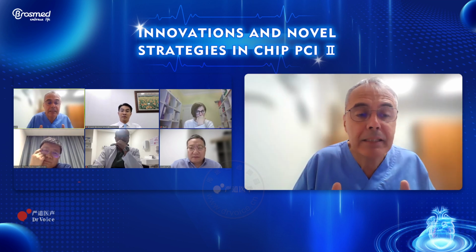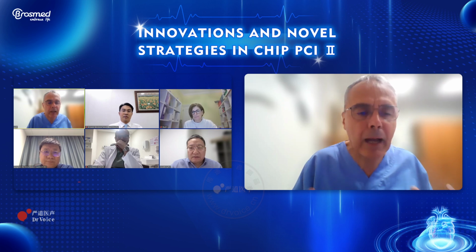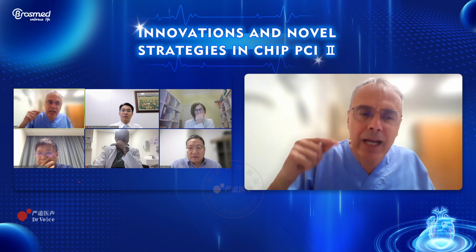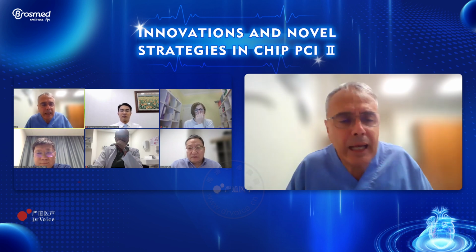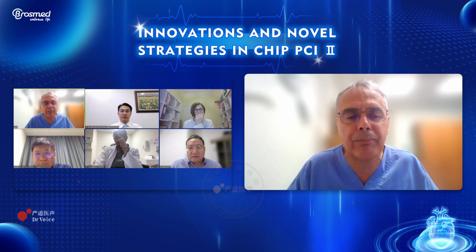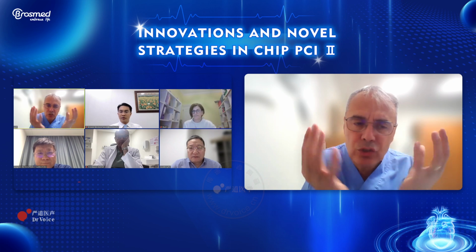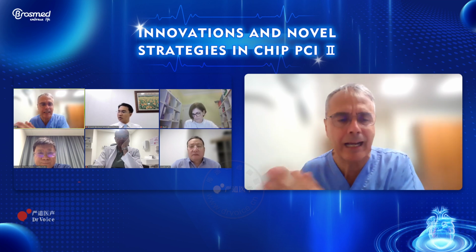Another important point is the dimension of this technology, 1.5 and 2.2. I believe that probably, apart from the cost, it is a new idea. I showed you the idea of a progressive diameter preparation, 1.5, 2.5, and if you need 3.2 and more. This is another important concept. Normally, we don't use this concept with the cutting balloon because we have only 2.0, but the profile is similar, 2.5. So this is a technology that combines in one device high pressure, independent wiring, and cutting.